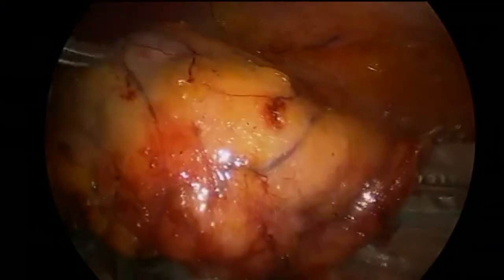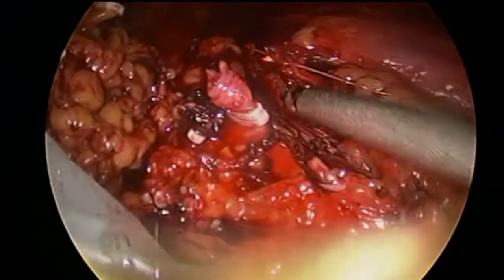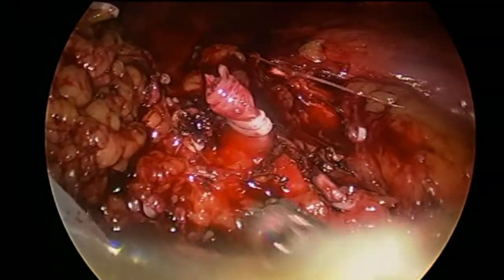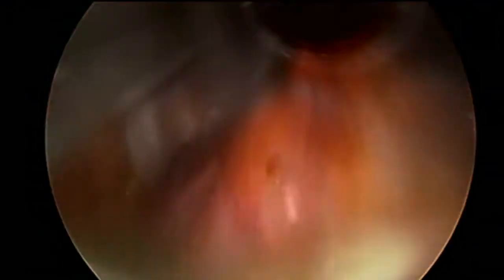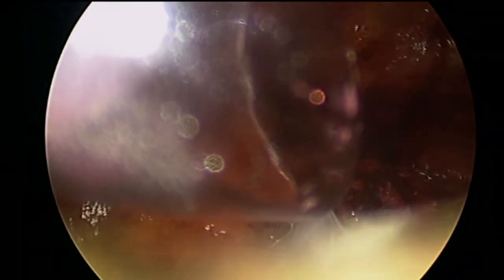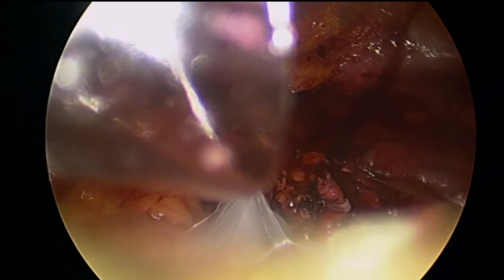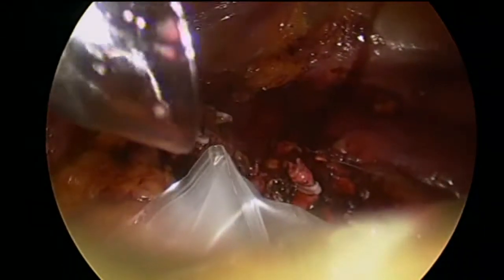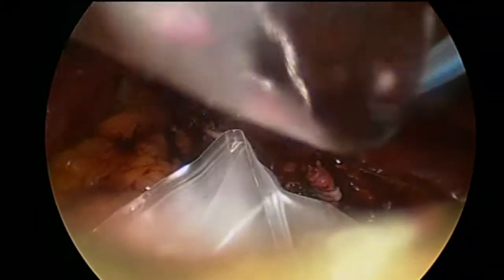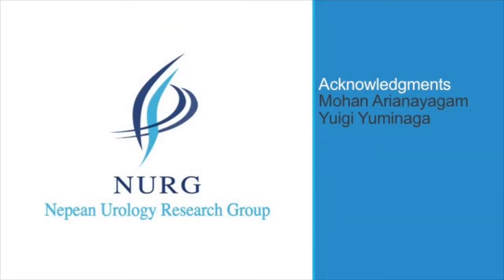When you bag the kidney, it's important to set it up so that it almost just slides into the bag. You have to put the kidney back onto psoas and then have a grasper holding it up, so that when the bag goes in, it goes underneath it. I tend not to change the port to a 15mm port, but if I was definitely going to need it, I'd probably just put a 15mm port in to start with. Otherwise, I just pull the port out, change the gas onto the 5mm ports and do it that way. I usually leave a drain in, even though I'm not quite sure why we need it.